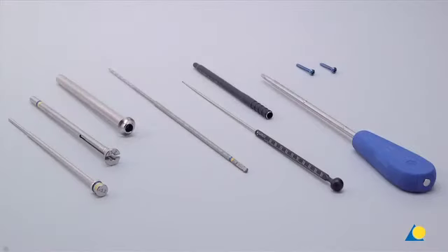The instruments needed for proximal locking include the trocar 3.2 mm diameter, the drill sleeve 8.0 3.2, the protection sleeve 12.0 8.0, the 3.2 mm drill bit calibrated, the depth gauge for locking screws measuring range up to 110 mm, and the screwdriver star drive T25 self-holding.